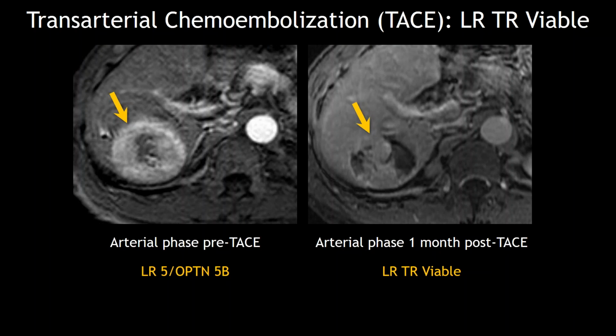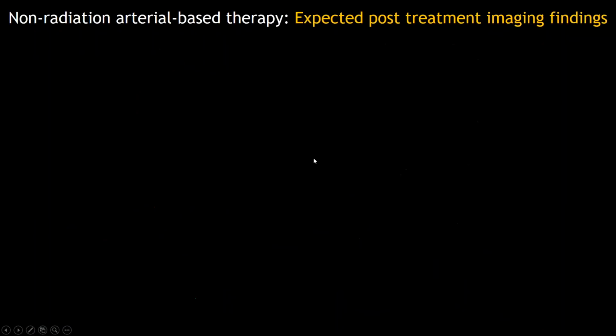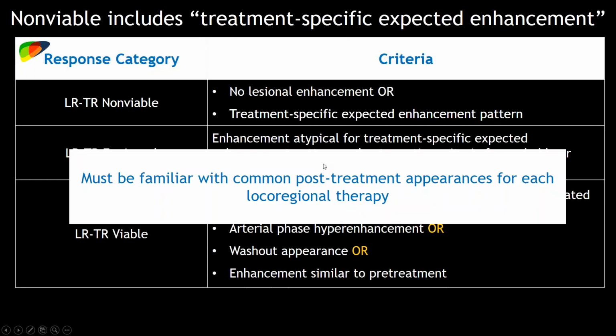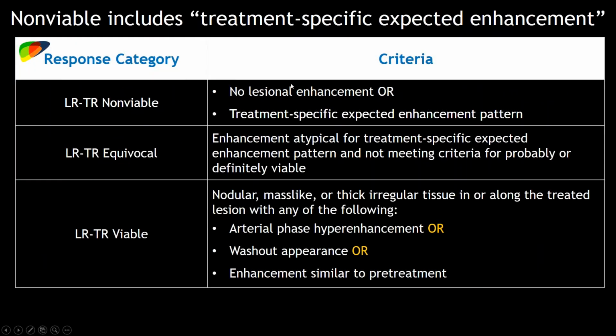Well, I think you know what I mean. Yeah, I think I probably just chose not the greatest image to put here, so I should change that for the future. But I think I agree with you. So based on the LI-RADS criteria, let me just go back to that one second. No lesional enhancement is non-viable. If we want to say viable, you're going to say hyper enhancement, washout, or enhancement similar to pre-treatment. So I think part of this was it wasn't the same phase, so it's hard to make that.